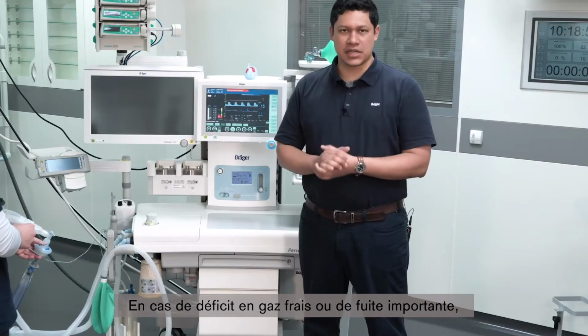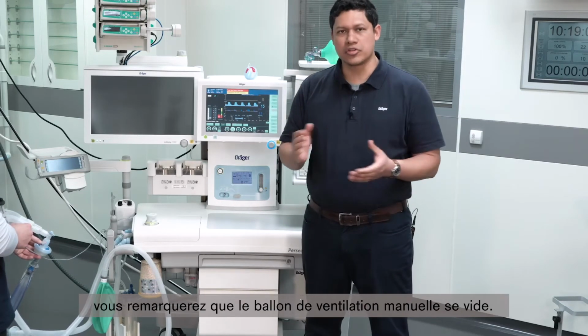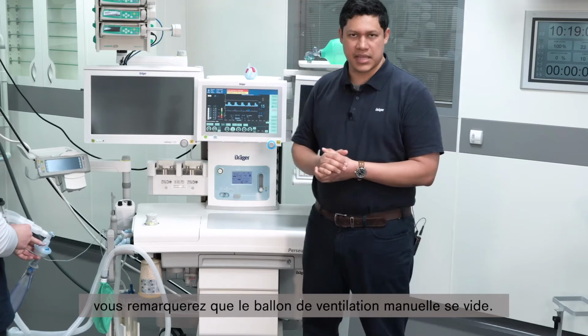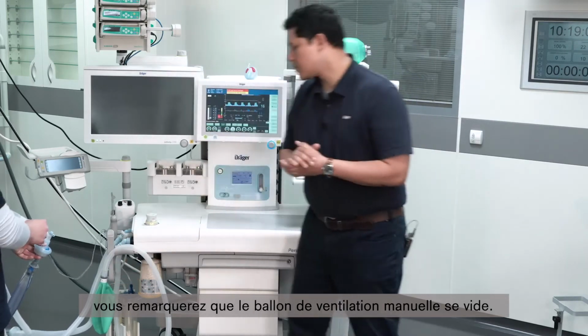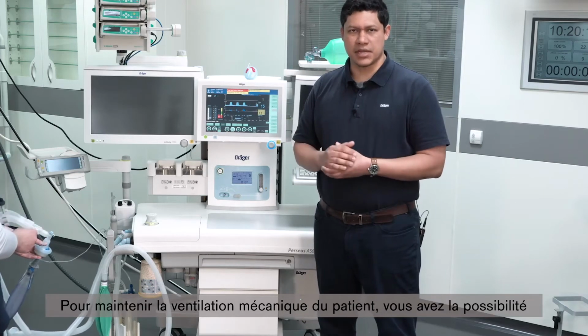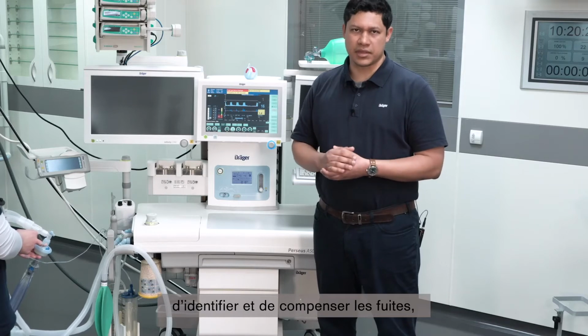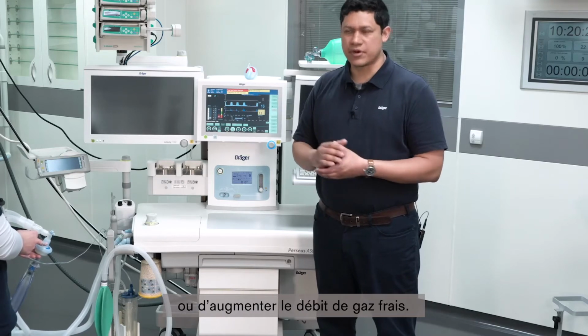In the case of fresh gas flow deficit or a big leakage, you will also notice that the manual breathing bag gets emptied. You should act immediately. To secure mechanical ventilation of the patient, you can follow the next steps. Identify and correct the leakages. Increase the fresh gas flow.